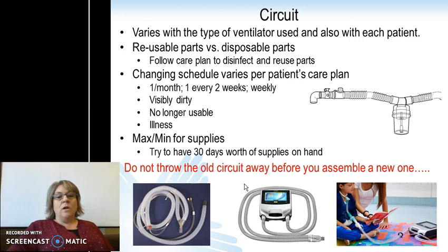Also be aware of the maximum and minimum for supplies with your patient. Try to have about 30 days worth of supplies on hand. You never know when something is going to be back ordered or unavailable for a while. A good piece of advice is to not throw the old circuit away prior to assembling a new one. You don't want to have to dig through someone's garbage in order to find all the parts you need to put your circuit back together.